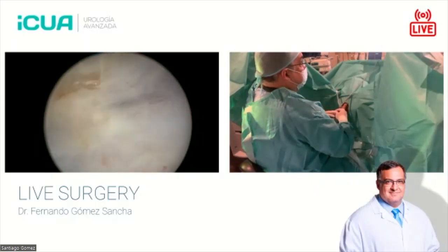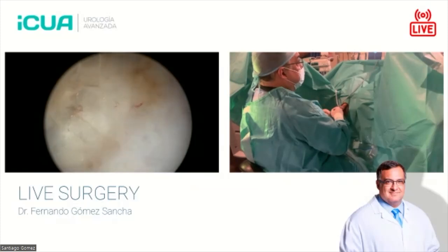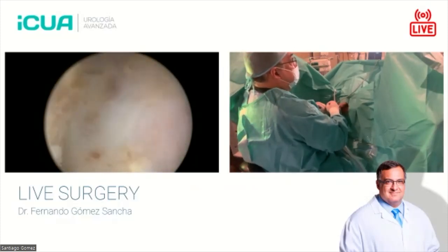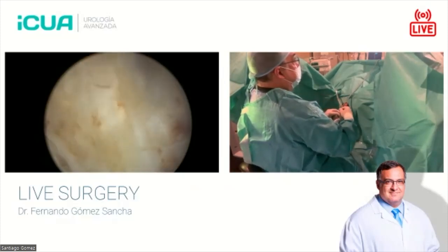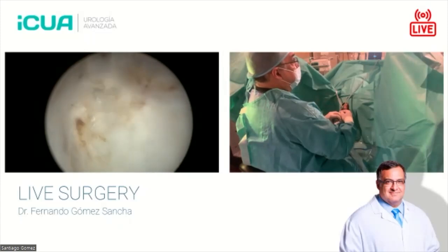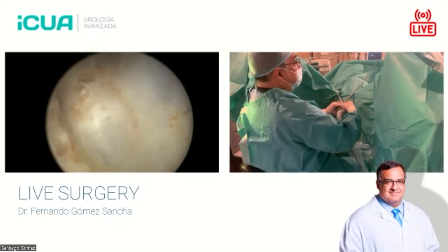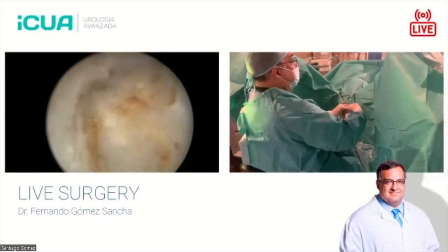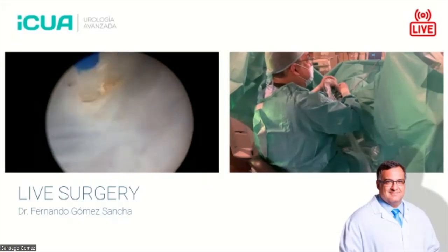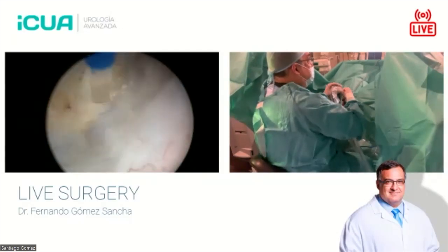So as I said, this little explosion that happens on the tip of the fiber is going to cause some shock wave that is going to help dissect the surgical plane following the path of least resistance. Of course, it's easier for the bubble and the expansion to follow the right plane than to penetrate the capsule or the adenoma. So I picture as if I had two little scissors on the point of my fiber, and every time I fire against the interface between adenoma and capsule, what I'm achieving is like the effect of the scissor blades spreading, so some expansion of the space and some dissection of the plane.